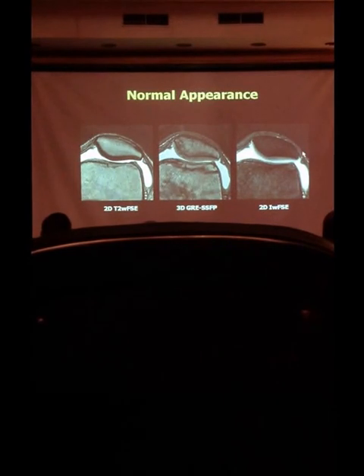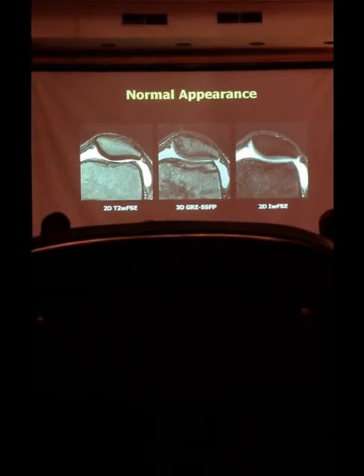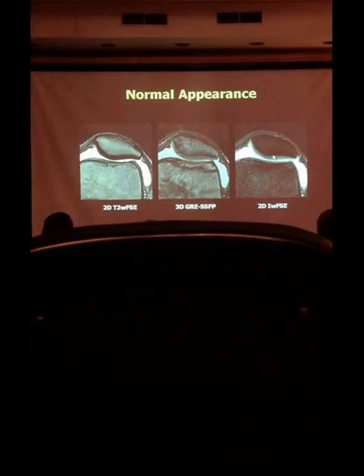You can see this other sequence here as well. Here we use fat suppression. We suppress the signal of fat. This is an intermediate weighted sequence, meaning that the time of echo that I told you about before is not too high, so it's between 35 to 60 milliseconds, and it's optimal to preserve signal from cartilage, keeping a great contrast between the articular cartilage and the synovial fluid, which is really bright. You can see here high signal intensity within the synovial joint, and the subchondral bone is black, especially because we suppress the signal of the fat.